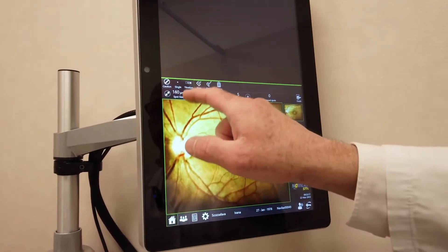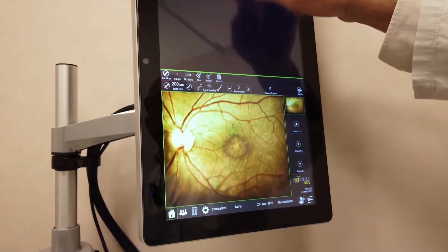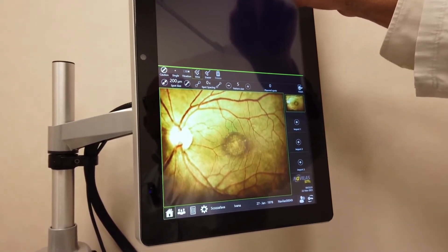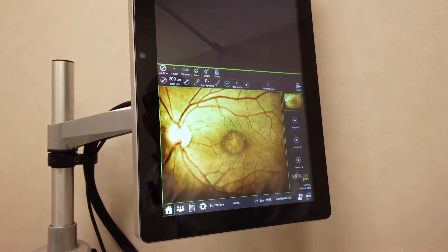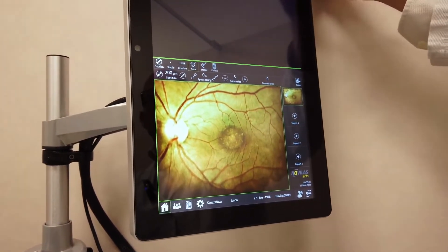The sizing of the spot: 200 microns. The power: 300 milliwatts. Then again the spot size has to be chosen, and the pulse duration: 200 milliseconds.